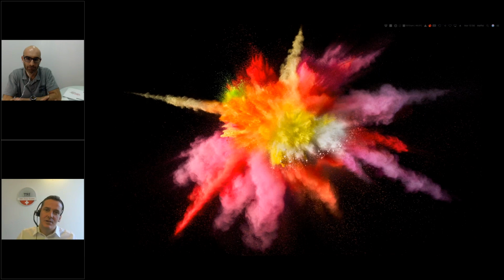It came out that 50 micron sandblasting would give a very good result. Or when you have a meshing treatment as we have, it also gives you the possibility to not sandblast, because you can keep the color, a pink color in our case, and have a bit of an aesthetic plus. So maybe I just answered that question.